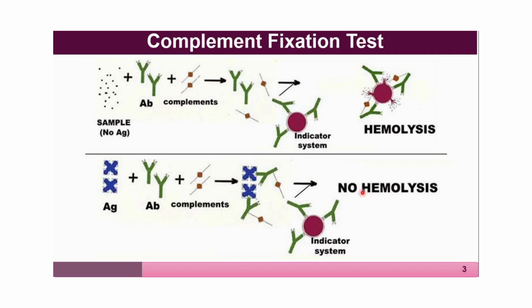It is just that we have changed the sequence. And the detection here we have done with the antigen, the presence of the antibody. Therefore, complement fixation test can be used for the detection of antigen or the antibody in the test serum sample.